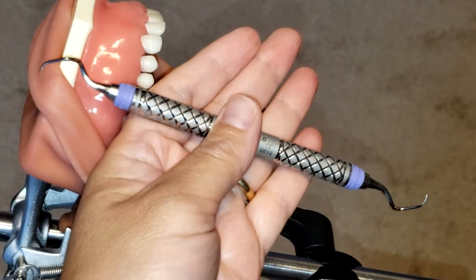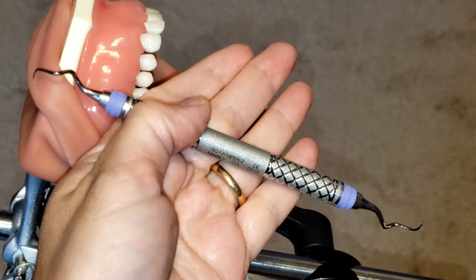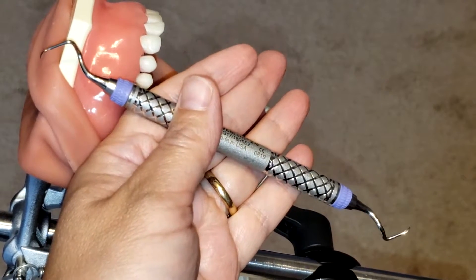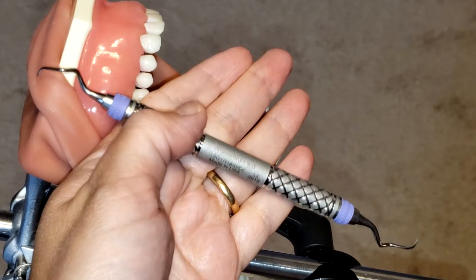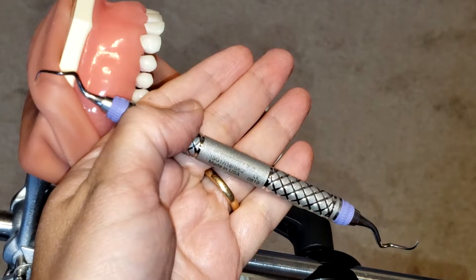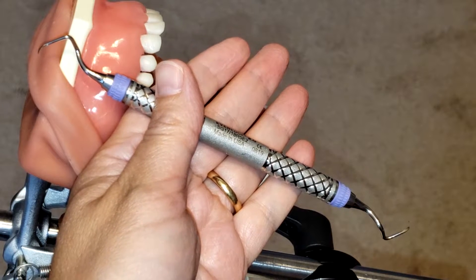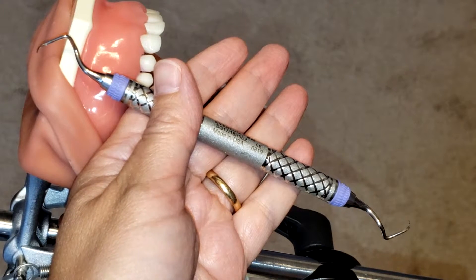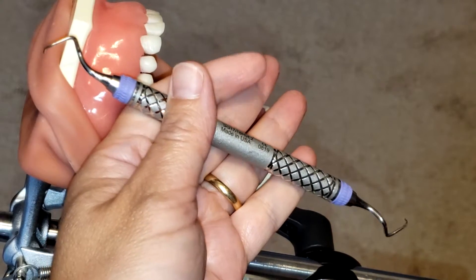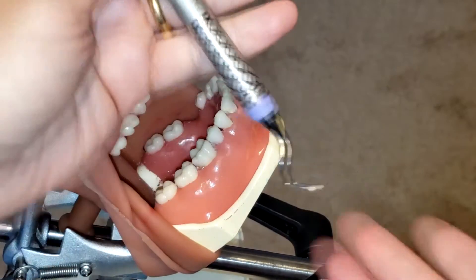Hello everyone and welcome. Today I'm going to be showing you how to use the Gracey 17/18 curette. This is an area-specific curette that is used on posterior teeth only — your molars and premolars — and it is specifically designed to be used on the distal surfaces only. This instrument is great for hard-to-reach areas, especially those behind the third molars. This is a periodontal instrument for moderate to heavy calculus removal.